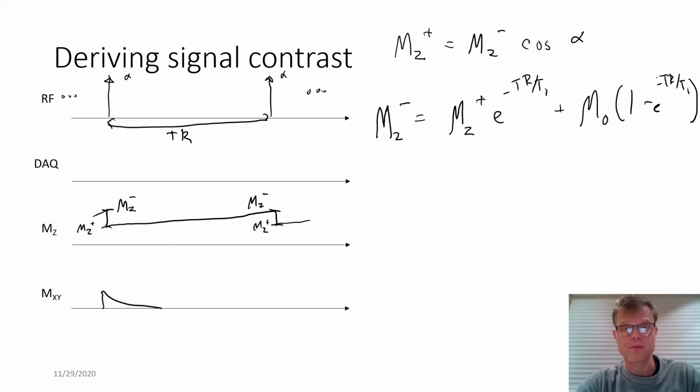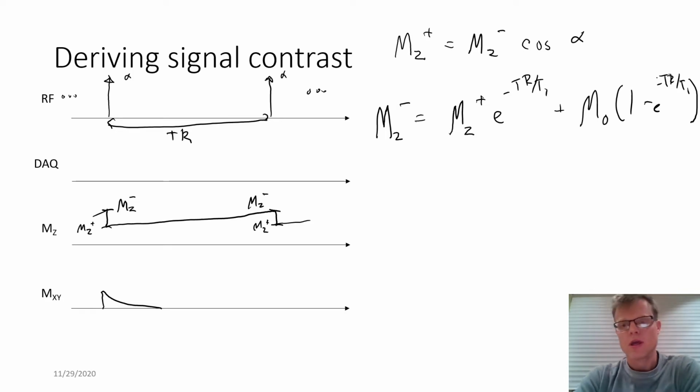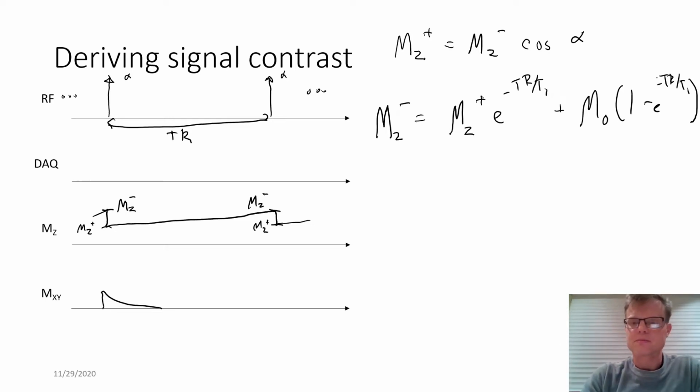If you're confused about where this is coming from, go back and refresh on the tissue contrast where we derived our T1 recovery signal equation.